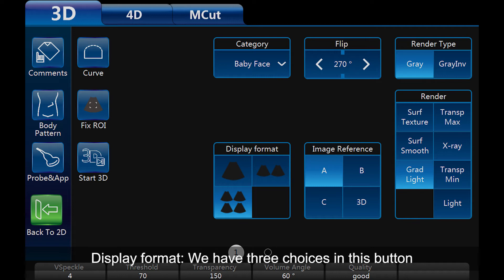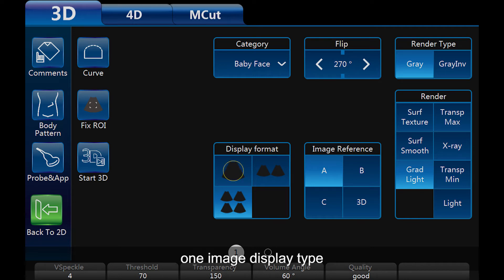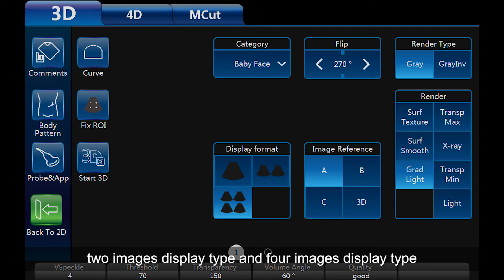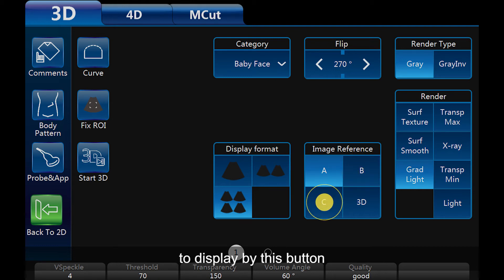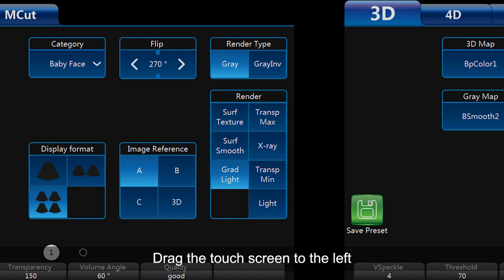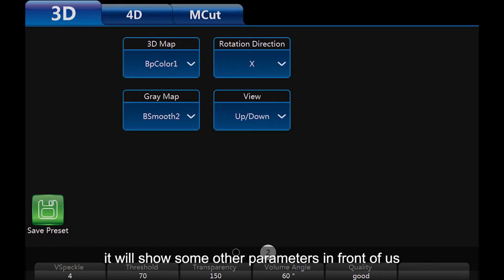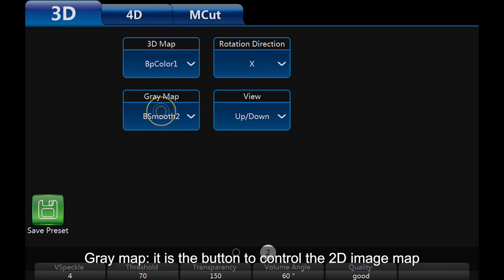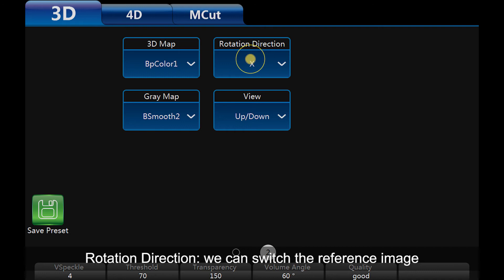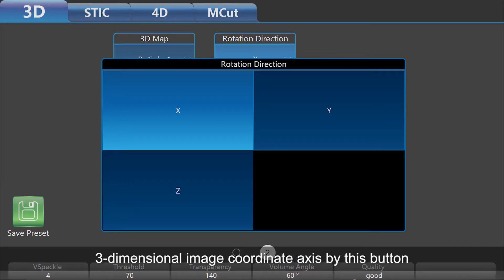Display format: we have 3 choices — 1 image display type, 2 images display type, and 4 images display type. Image reference: we can choose different images to display using this button. Drag the touch screen to the left and it will show some other parameters. 3D map: we can change the render image color. Grey map: controls the 2D image map. Rotation direction: we can switch the reference image 3-dimensional coordinate axis using this button.